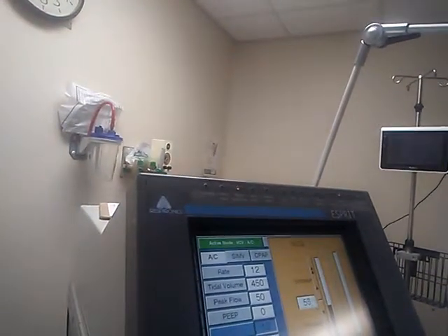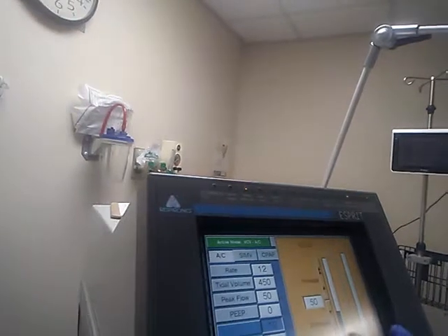Now, we're on 100% O2. We do not need 100%. We're changing it down to 50%.